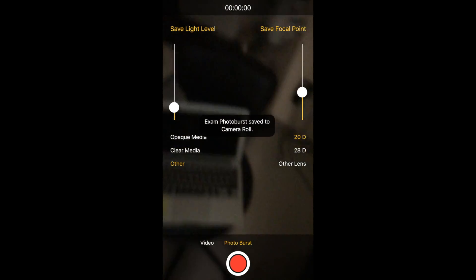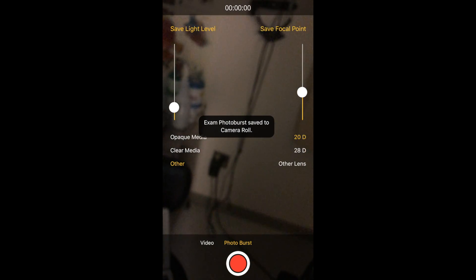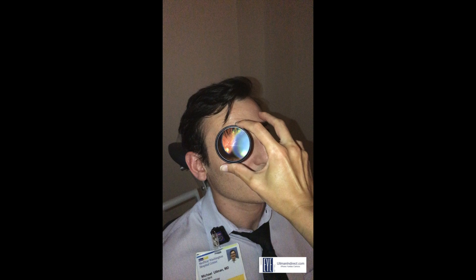The photos are all then saved to your camera roll. Here's an example of a final product — it's a poor example, but you get the idea.